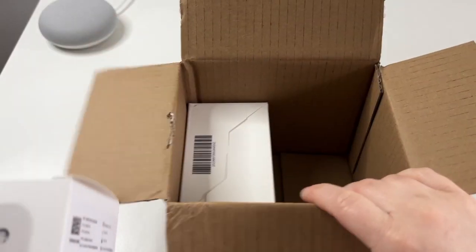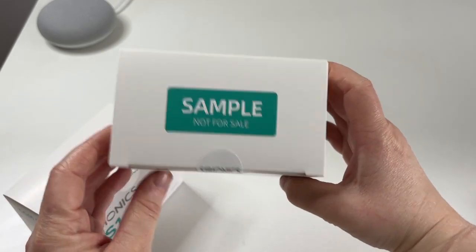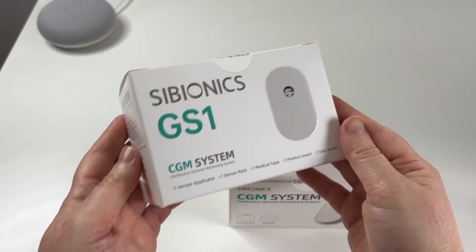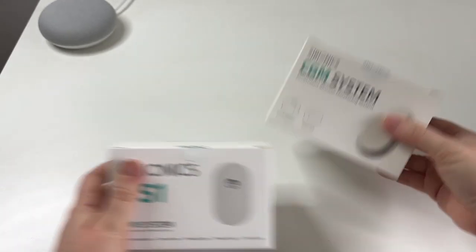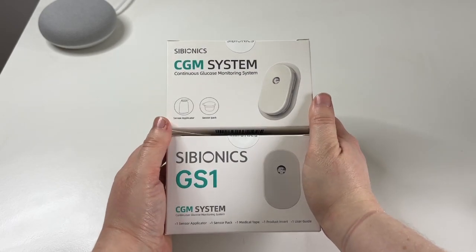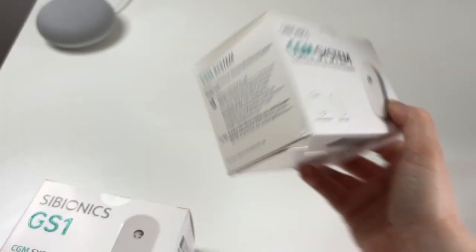So I just opened the box and I see that I've been given two. This is a sample pack so it's not for sale. That's one they sent me there, and then this is the CGM — the Sibionics GS1 CGM system. This is what I believe it would look like if you purchased it. They've given me two which is great because I'll be able to do both videos.